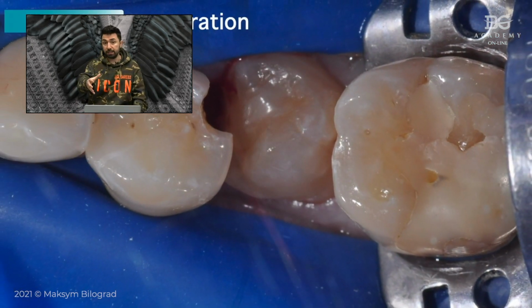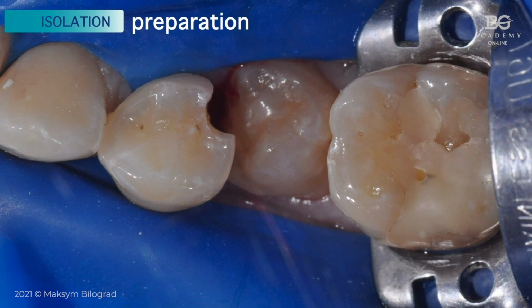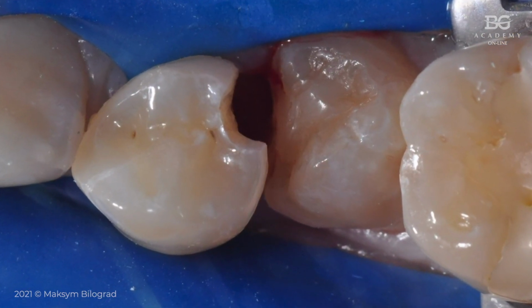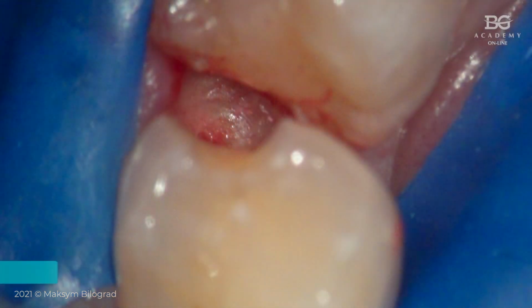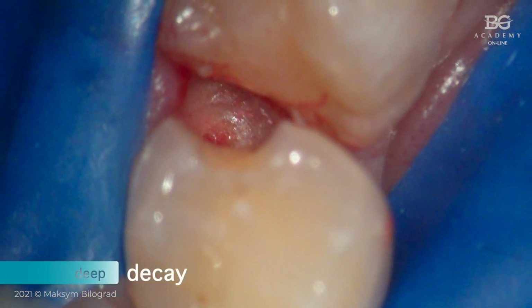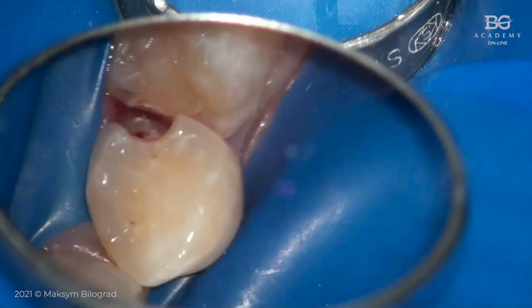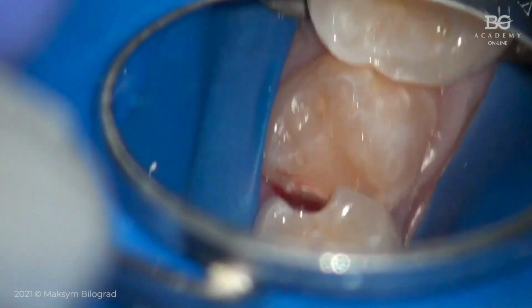So we made this split dam isolation. Split dam allowed us also to excavate caries and to make a gingivectomy. In this case we had to because it was very deep. Here you can see the picture, the very deep defect, actually the root surface. And when you have this root surface, you have to deal with soft tissues.